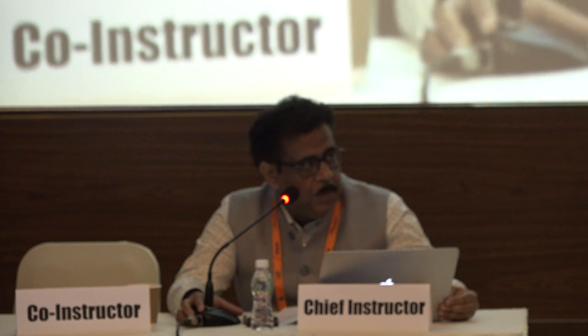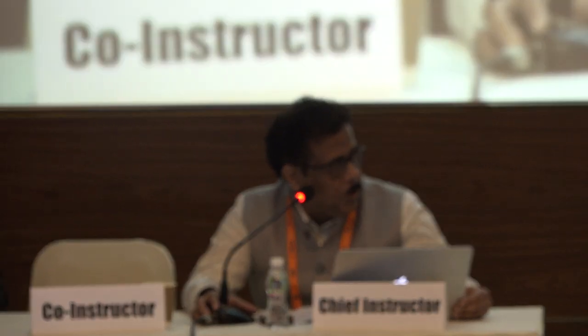Thank you, Dr. Shantanu. I have a few questions, like whether this cyst was preoperatively visible or not? Not visible. It was at the periphery. Some abnormal vascularization, but that is not clear due to the cataract changes in the lens. Complicated cataract was there, media was also PVR changes, vitreous haze was there. So it was at very periphery.